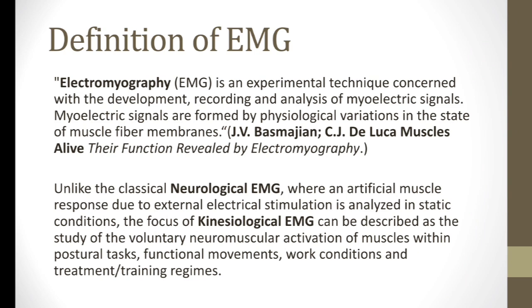So today we'll discuss EMG and its concept. EMG, also known as electromyography, is an experimental technique concerned with the development, recording, and analysis of myoelectric signals, which are formed by the physiological variations in the state of muscle fiber membrane. And classical neurological EMG, where an artificial muscle response due to external electrical stimulation is analyzed in static condition.